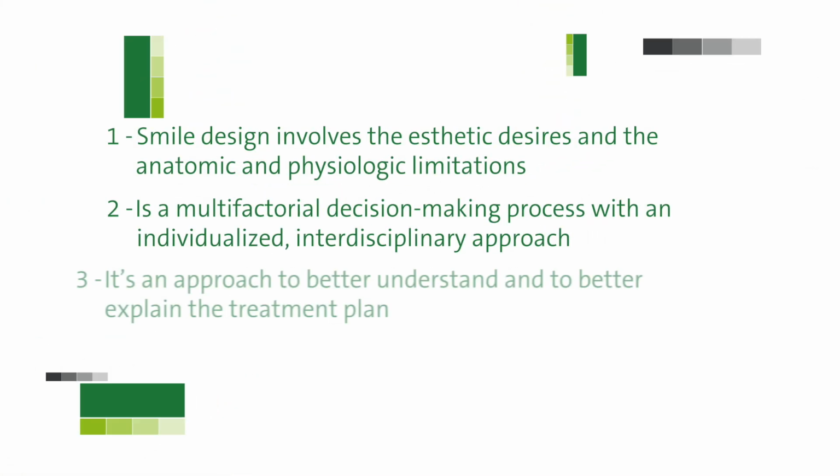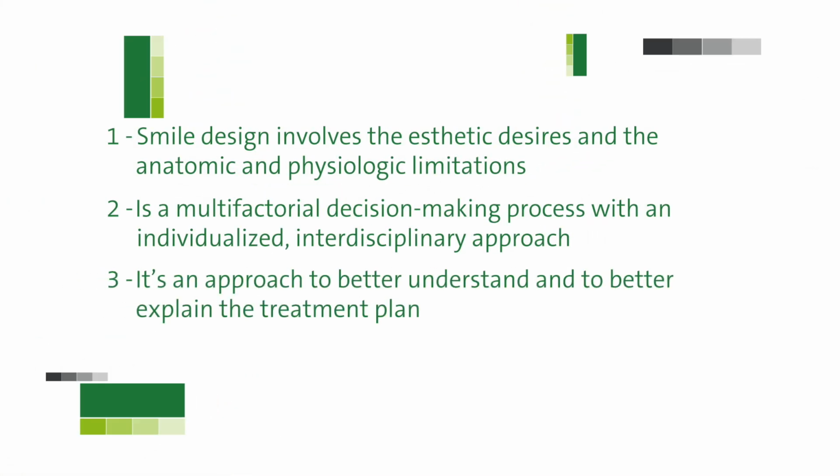As a result, it's important to know the ways to better understand and to better explain the treatment plan to our cases. Patients report that a lack of visualization of their treatment plan puts them into a discomfortable position, followed by fear and loss of independence. However, patients reported that being able to see their final result gives them a peace of mind.